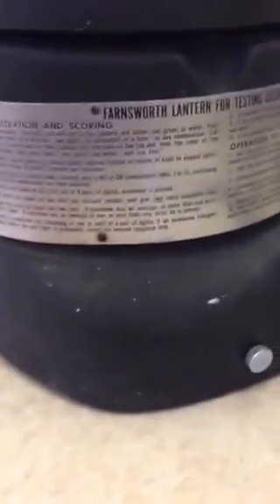You'll need the recording form from the Department of Defense. This includes both the answer key and also the instructions on how to perform the Lantern test. I'd like to point out that on the back of the Lantern, bolted to it, are the instructions as well.